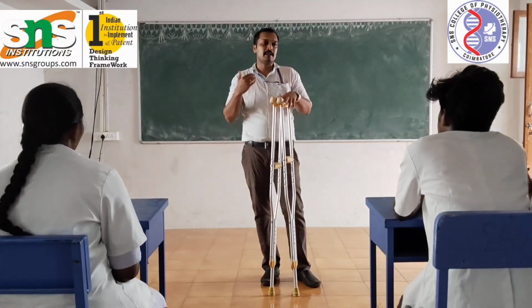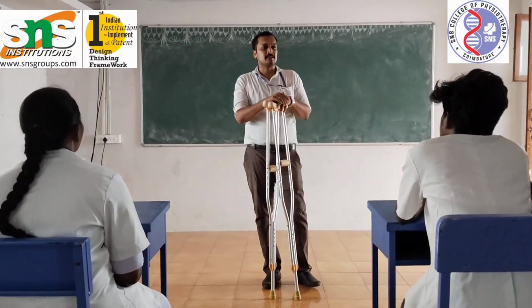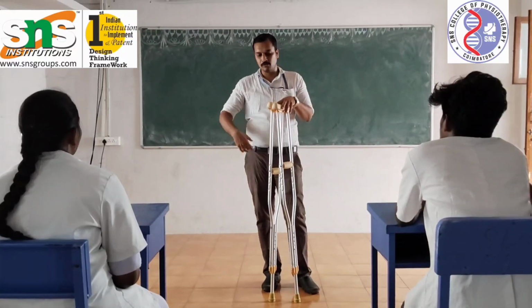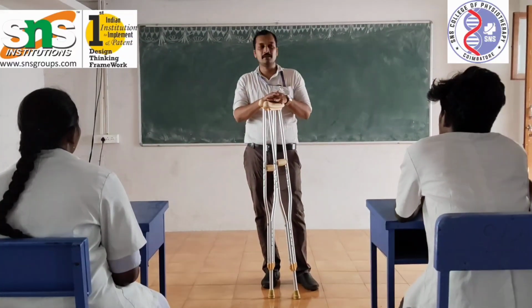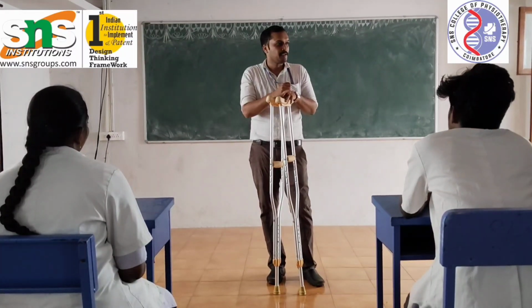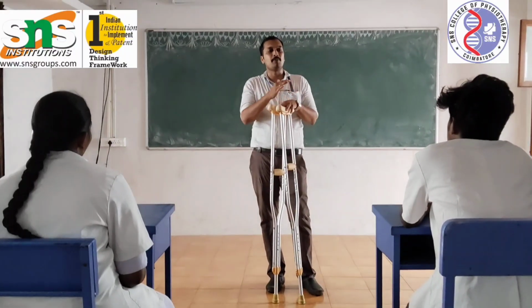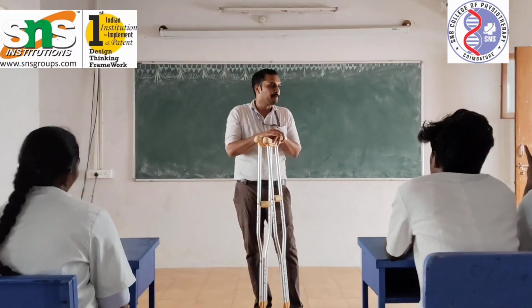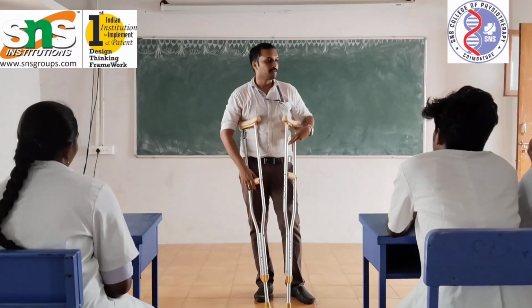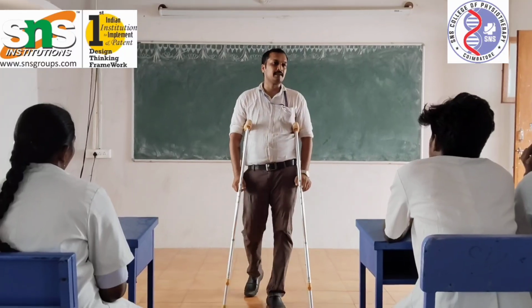After any injury or any surgery, what will the orthopedician suggest? After surgery, is the patient advised to walk with full weight bearing? No. Initially they go with non-weight bearing, then progress to partial weight bearing, and from partial weight bearing progress to full weight bearing. We will see one by one. Initially, non-weight bearing. Assume that I have some problem in my right side lower limb.